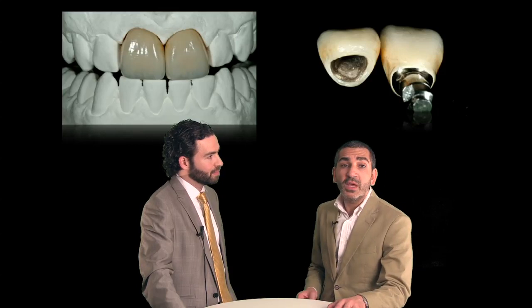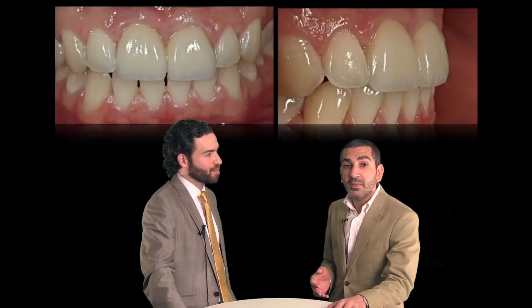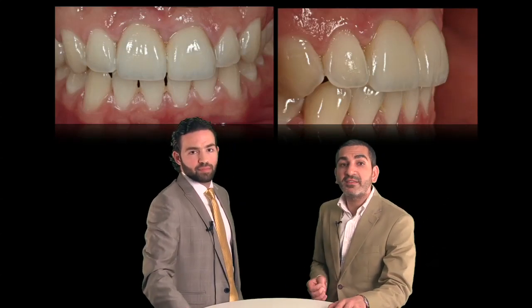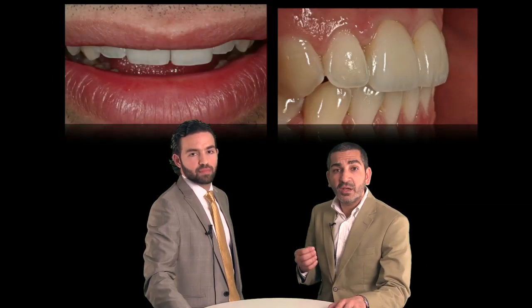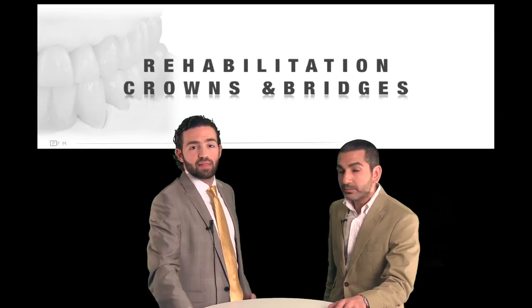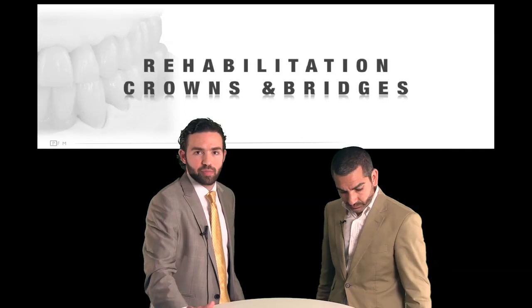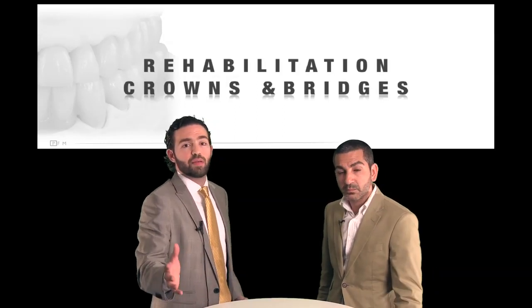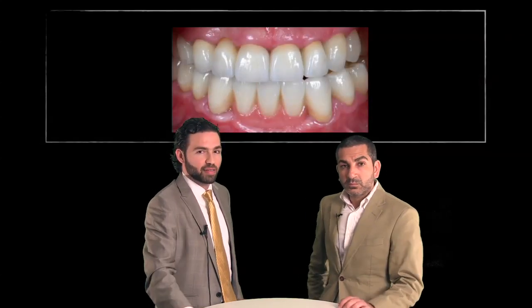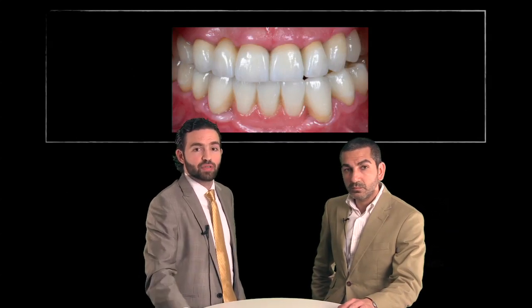So please don't be ashamed of using porcelain fused to metal crowns. We really should not be a victim of advertising. We need to be thinking about these things in a logical way so we can have practices that are based on sound principles. Sometimes even rehabilitations with crowns and bridges. We showed you earlier that the best material to choose on fixed partial dentures or bridges is really porcelain fused to metal. And in this instance, I've showed you this case earlier, but I didn't show you the post-op. This is how the post-op was done.